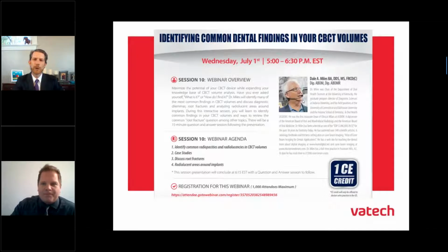Perfect. So yes, Paul, we're bringing up Dr. Dale Miles today. Like you said, we've actually worked with him 3 times. The first session we had a couple months ago was about 2-dimensional panoramic images transitioning into the 3D or CBCT volumes, and what are we seeing in the comparison. The last session we did about a month ago was CBCT volumes and really heavily on anatomy, understanding what we're looking at. And today we're evolving that into the third stage of that, which would be common dental findings. He's going to really go through that.